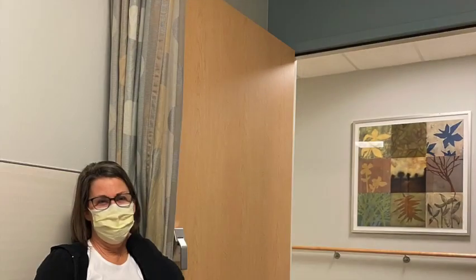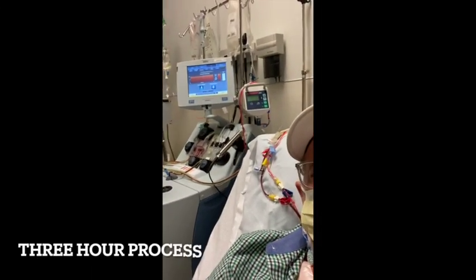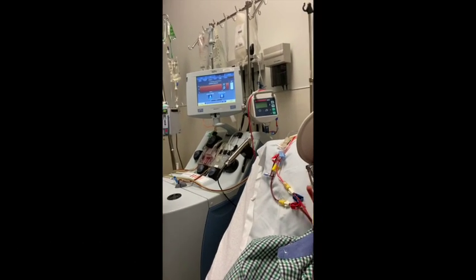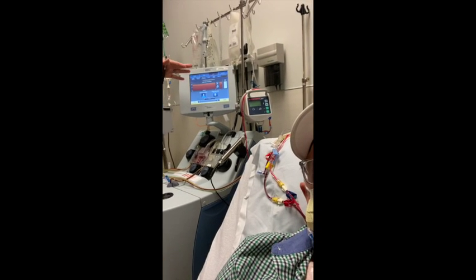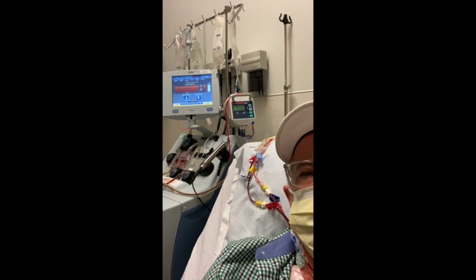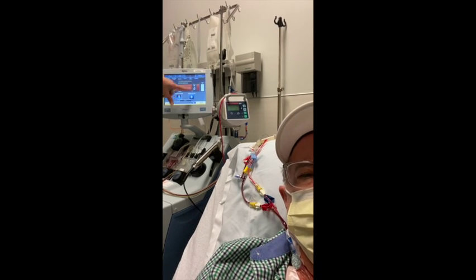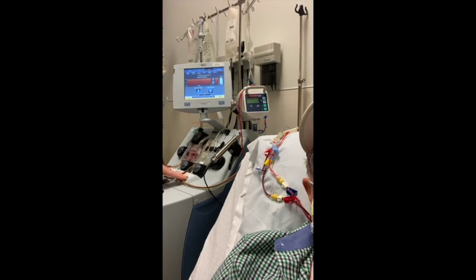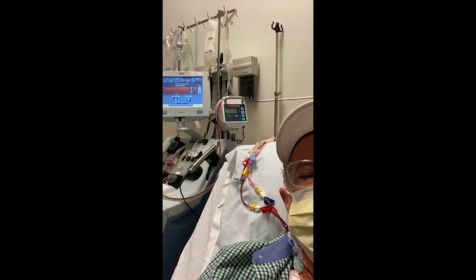You could do it better. I could go deeper, whereas if it was a patient donating to another patient, I would want to go a little higher because I don't want a whole bunch of red blood cells, especially if they were a different blood type. Do you have to manually adjust? Yeah, so I can use these up and down arrows — I could go deeper or lighter depending on what color I'm kind of targeting, depending on what I'm trying to collect.